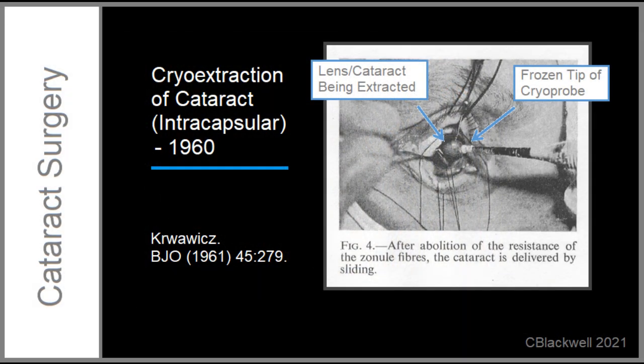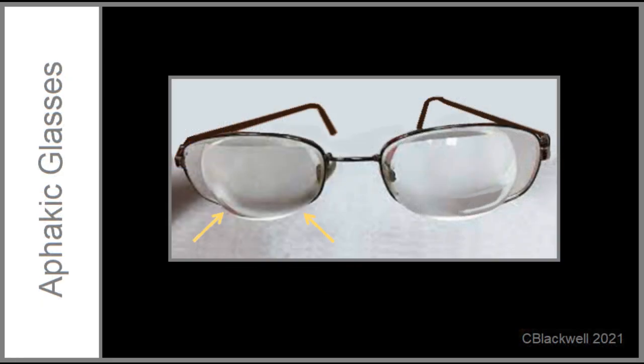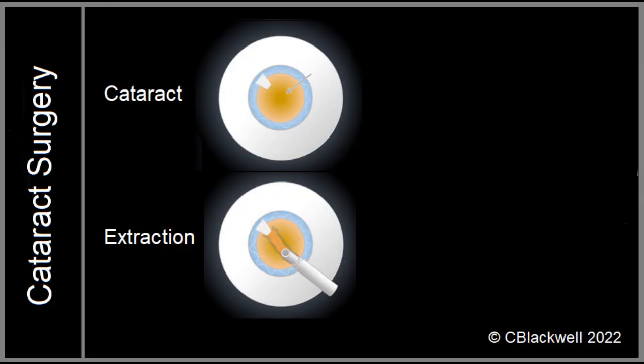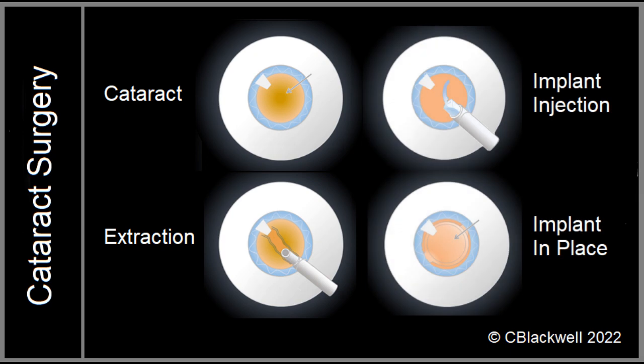As we come to the end of our discussion of lens implants, we should appreciate that it was only a few decades ago that cataract surgery was rudimentary, and there were no implants, only glasses with thick, heavy, vision-distorting lenses. Improvements in lens extraction methods and lens implant technology have made cataract surgery one of the most successful procedures in modern medicine.